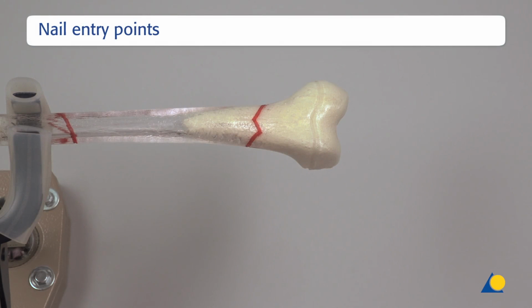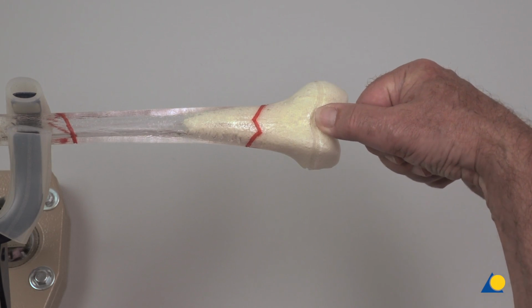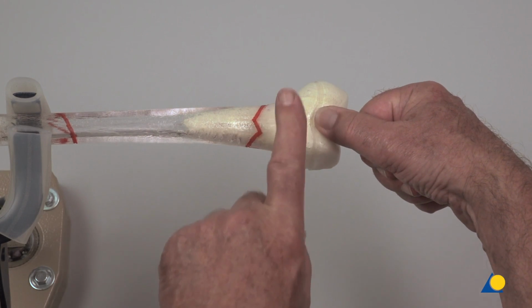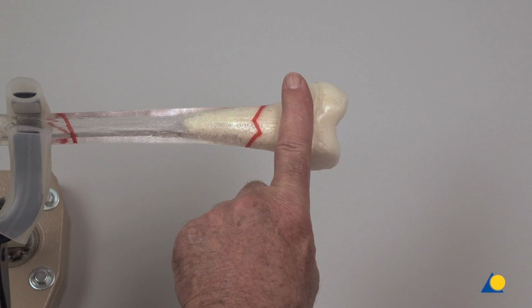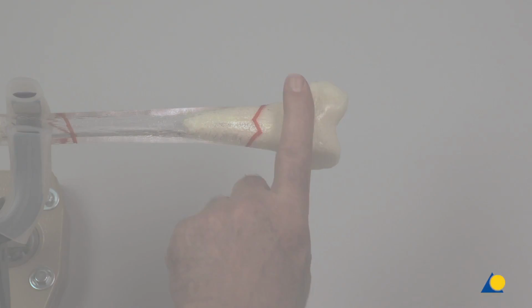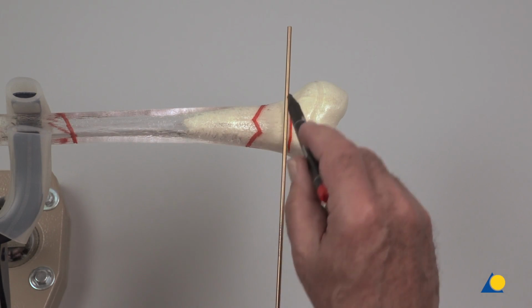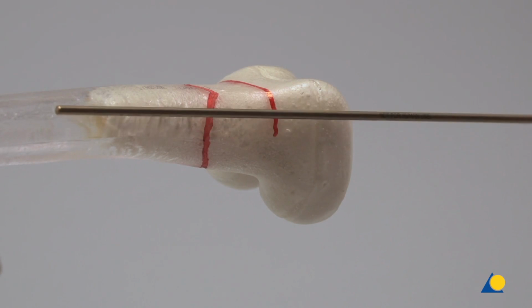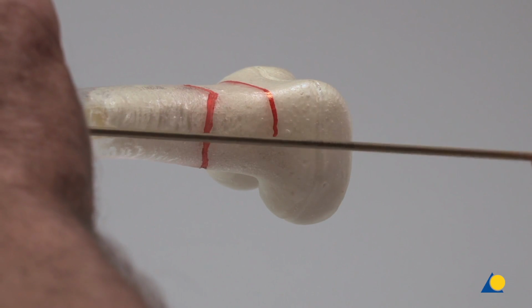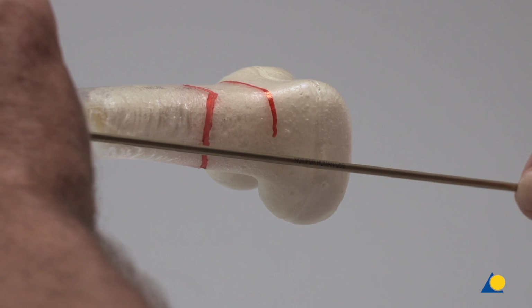The entry points on the femur should be 1.5 to 2 centimeters proximal to the distal growth plate. In children, this is an average of the width of a finger proximal to the upper pole of the patella. The entry points are marked on the lateral and medial sides, matching the central line of the shaft. The entry points are not on the central line of the condyle.